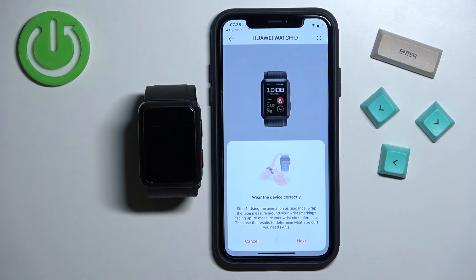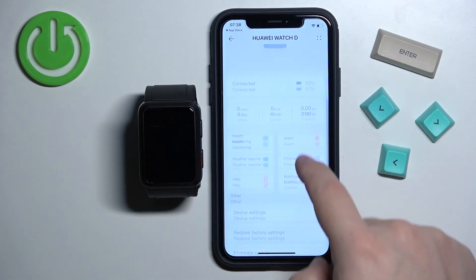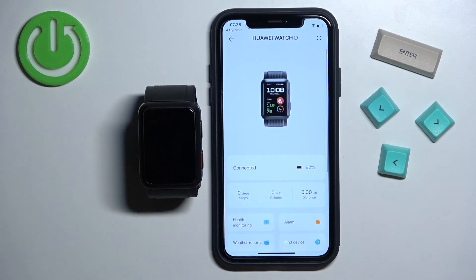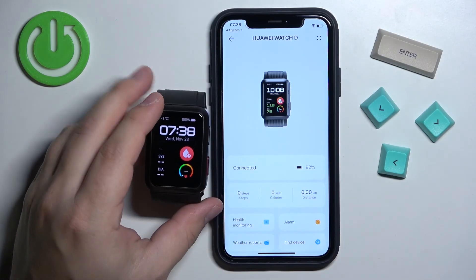Right here we have a tutorial on how to use the blood pressure measurement device on the watch — I'm going to tap Cancel to skip it. As you can see we now have the device page for our Huawei Watch D, and when we wake up the screen it's ready to use.